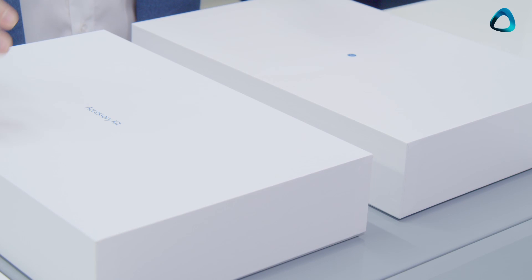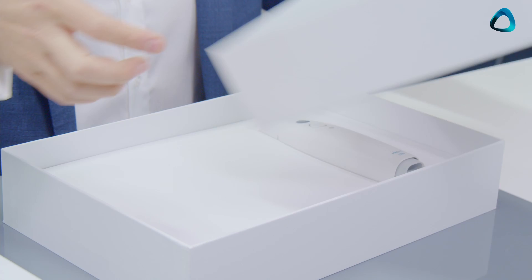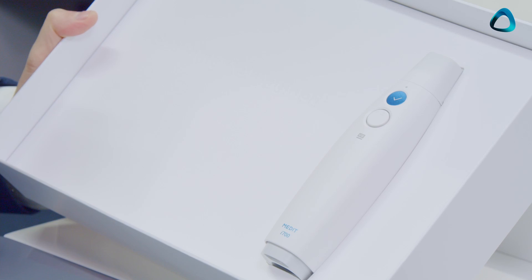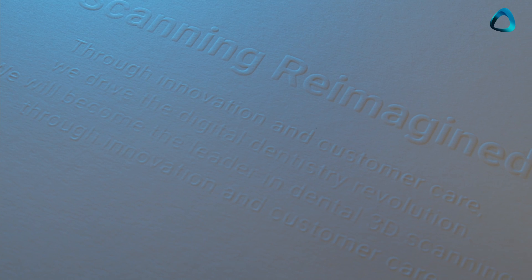When you open your Medit i700, you'll find two boxes — one is the scanner box and one is the accessory kit. Starting with the scanner box, one thing you'll quickly realize is that the presentation of this intraoral scanner is quite amazing. As soon as I opened it, I felt like I was opening an Apple product. This is the Medit i700 in all its glory — almost like a showpiece. Written on it: 'Scanning reimagined. Through innovation and customer care, we drive the digital dentistry revolution.' Some pretty powerful words from Medit.